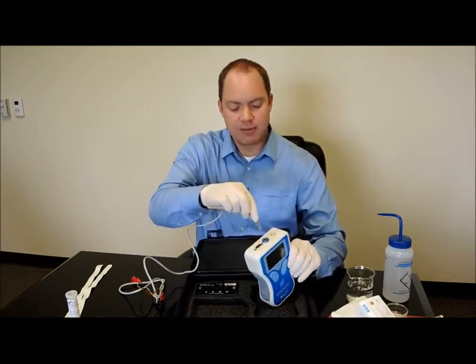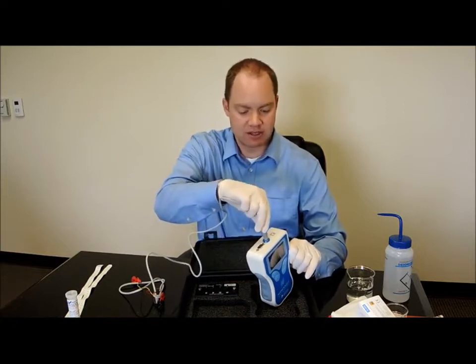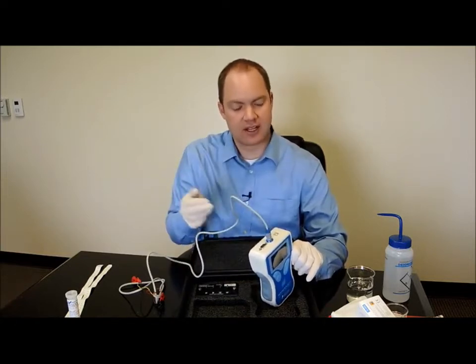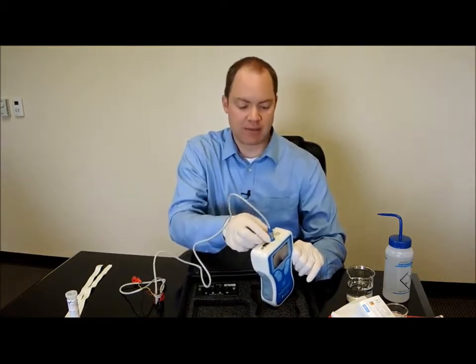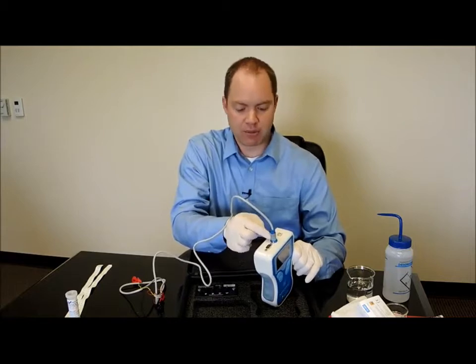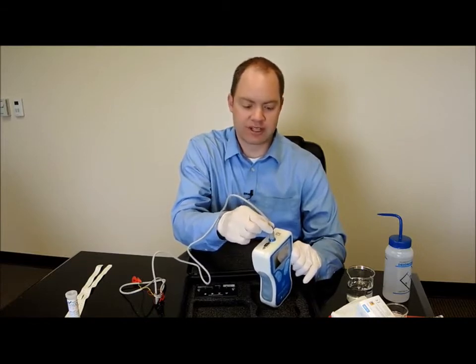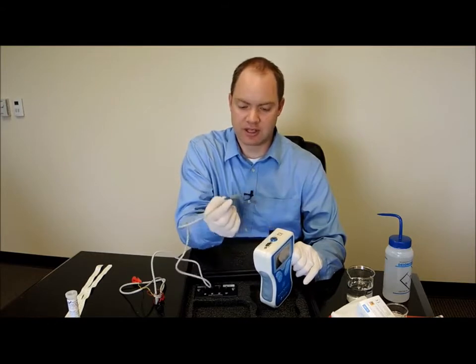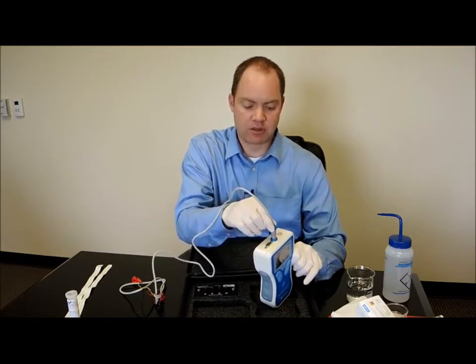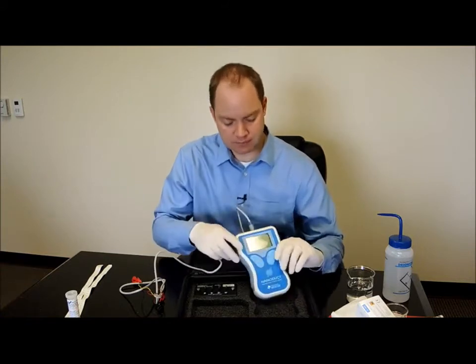You connect the cable to the top of the Nanoduct. The cable is keyed, and so it can only fit one way, and it connects with a nice snap like you heard. To release the cable, you pull up on the gray portion of the cable like so. If you pull up on the blue portion, it won't release. So you pull up slightly on the gray portion and it will release, and that's how you release the cable. To attach it again, you just press straight down and you hear a nice snap.